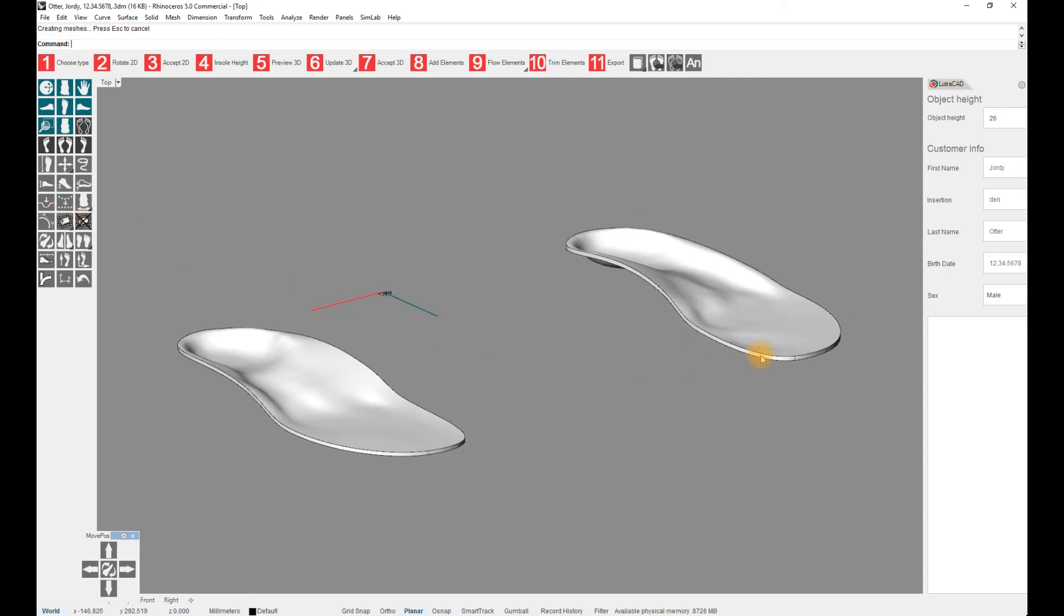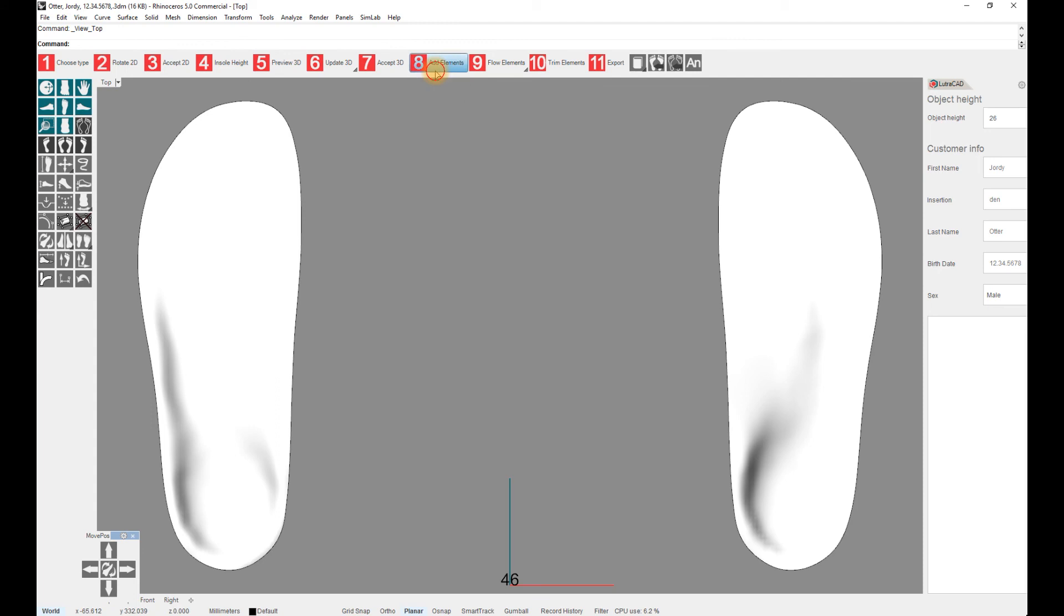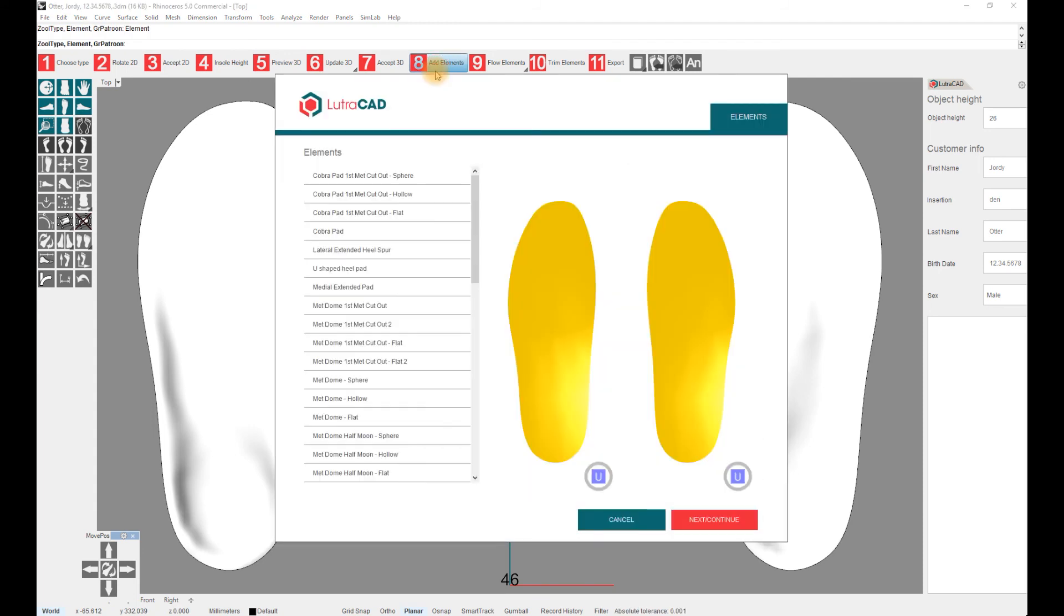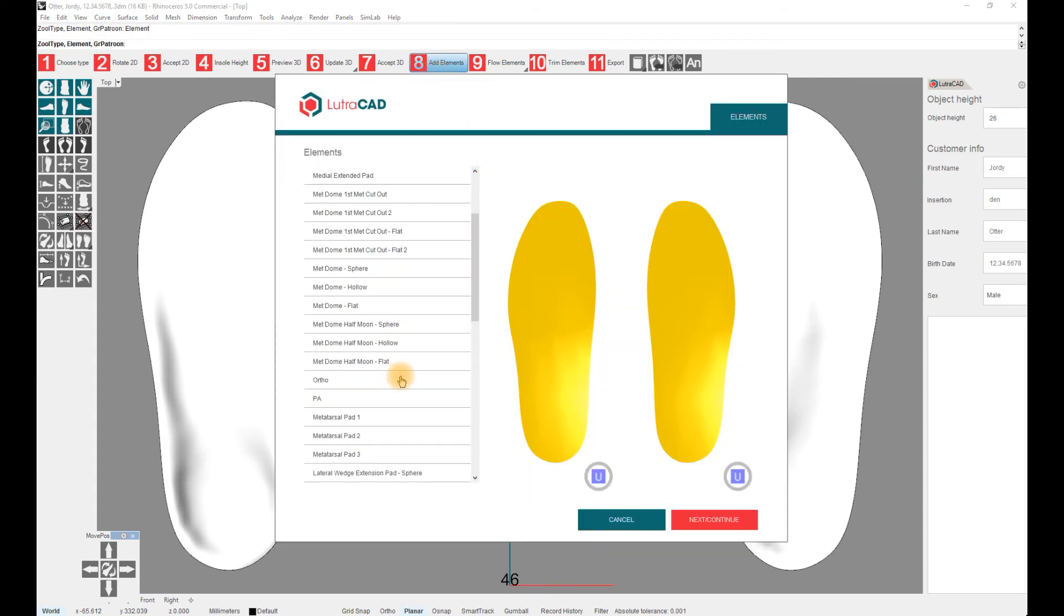If needed, an element can be added in step 8, Add Elements. An element can be selected or deselected by clicking on it with the left mouse button and added to the file by pressing Next.